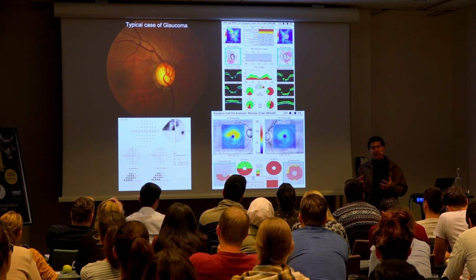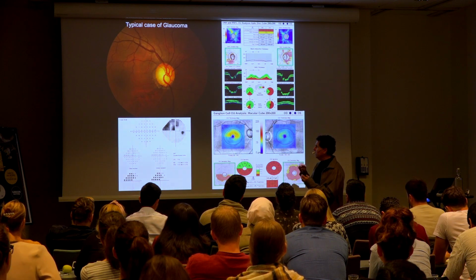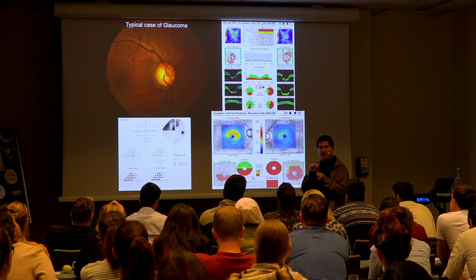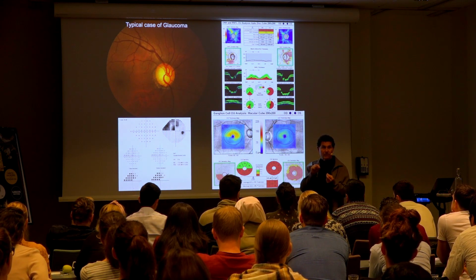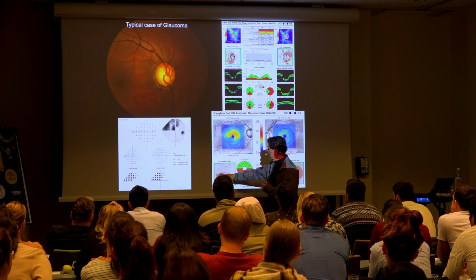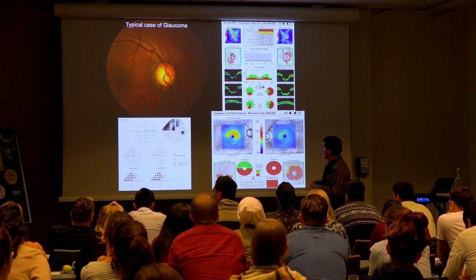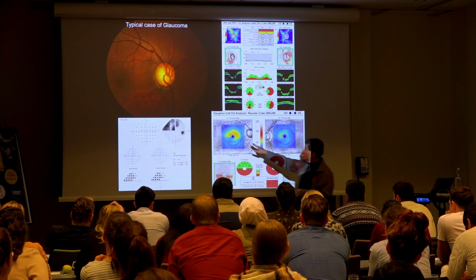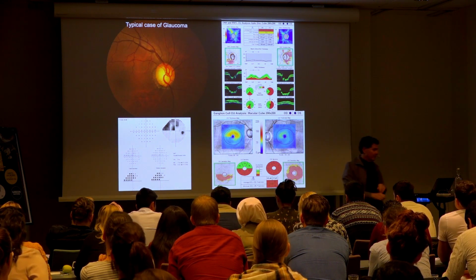So in glaucoma, like other optic neuropathies, look for a correlation between where you're losing the nerve fiber layer and thinning of the rim in that location, which the OCT will give you on exam and also your fundus exam. And this is an example of these types of arcuate macular bundles that you'll see in glaucoma. Sometimes they'll be so extensive that it'll be diffuse, but this will be the earlier stage where it's affecting just one arcuate bundle.